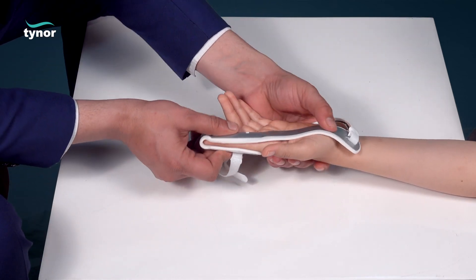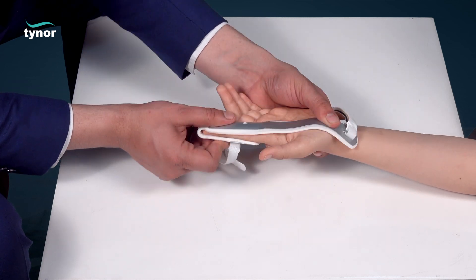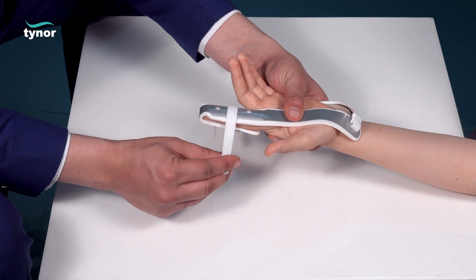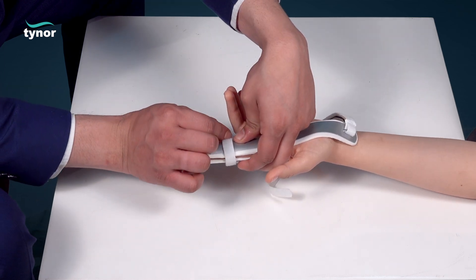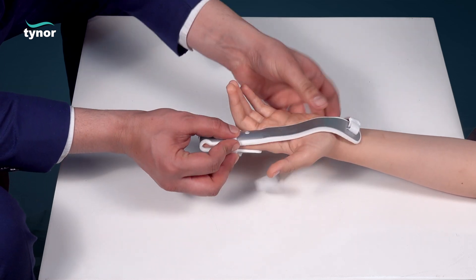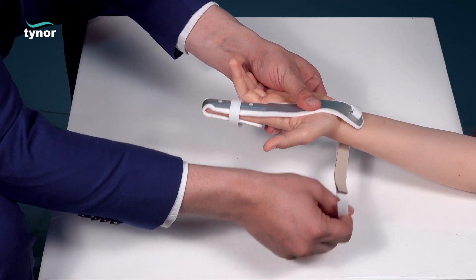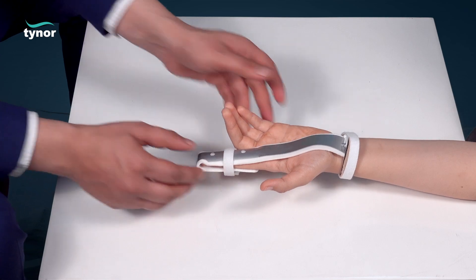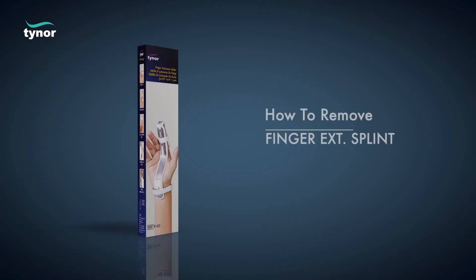Now fasten the tape into a comfortable tight position. Now let us see how to remove the finger extension splint.